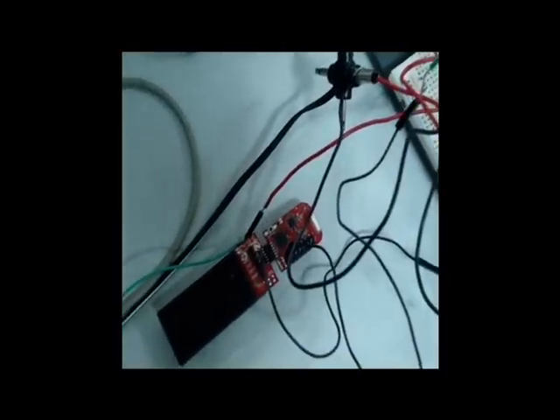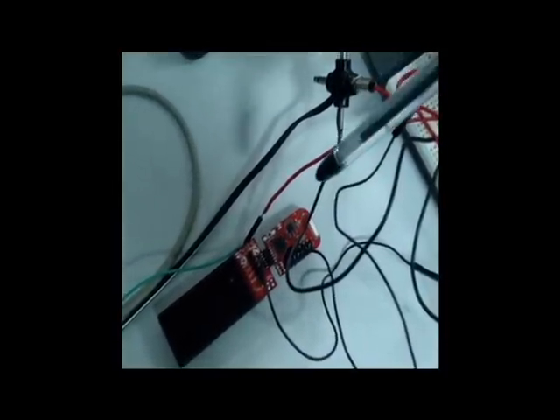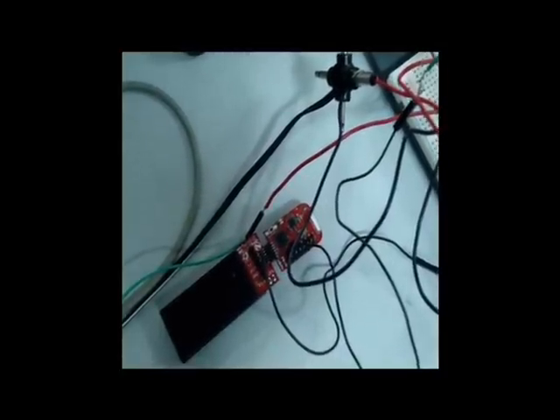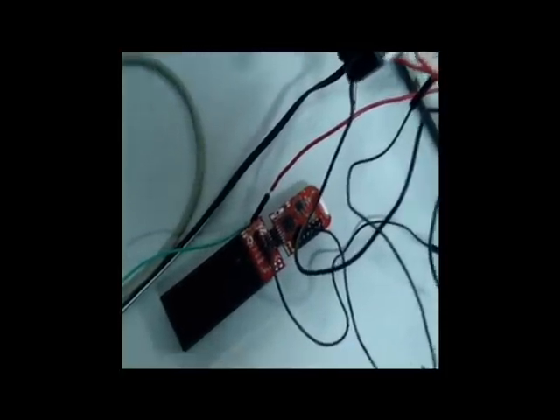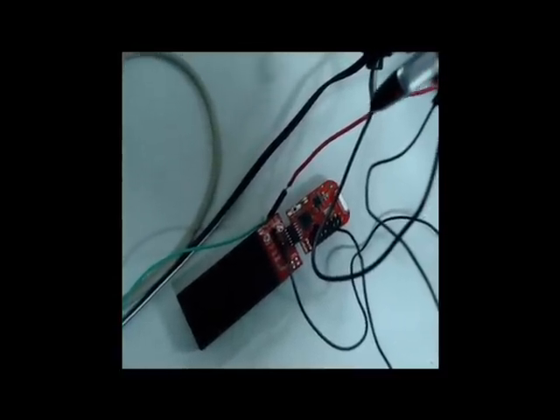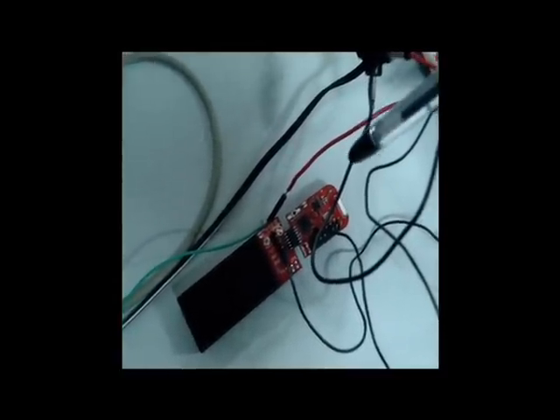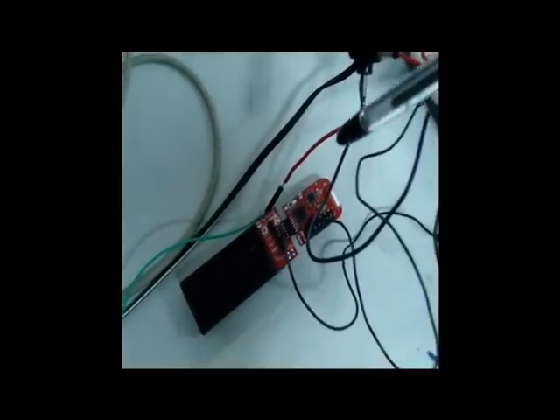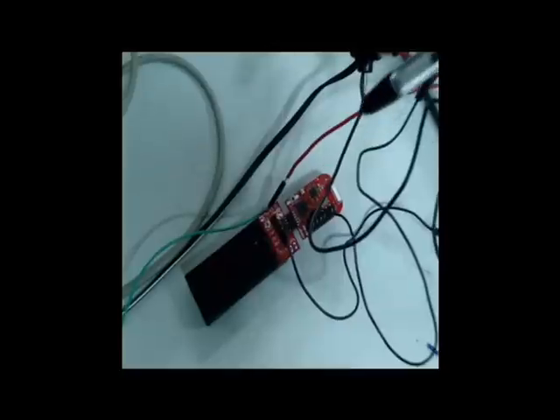Now coming to the microcontroller on the transmitter side, which takes as input the PPG waveform from the analog module. The ADC is configured in a single channel repeat sequence mode. The sampling is triggered at every timer interrupt, and the timer generates an interrupt every 25 milliseconds. The transmitter sends a sampled value of the signal every 25 milliseconds to the receiver, which is in connection with any remote PC.